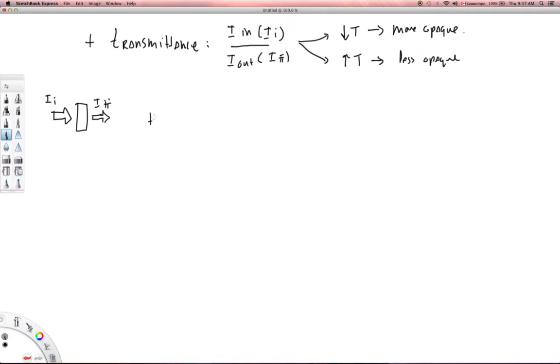All right, the next concept is something known as absorbance. Absorbance is, in a certain sense, the opposite of transmittance. Transmittance is how much actually got transmitted through there, how much actually made it through. It's a ratio of what was going in to what made it through. Absorbance is how much actually got absorbed, or it's a way of looking at that.